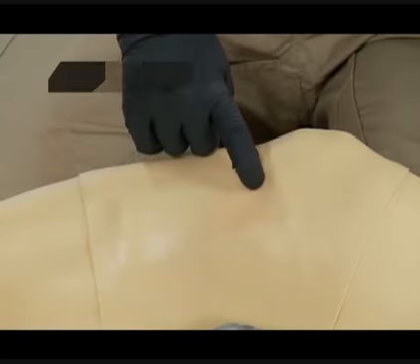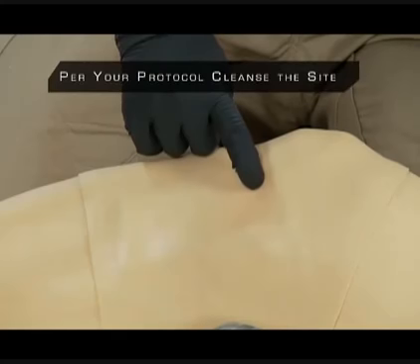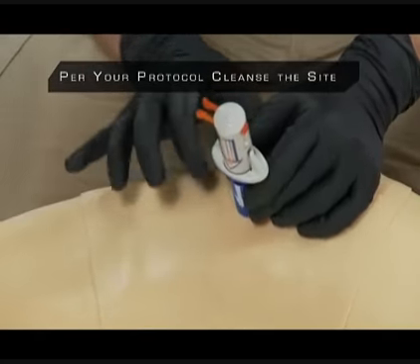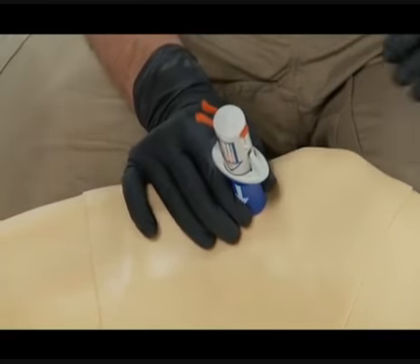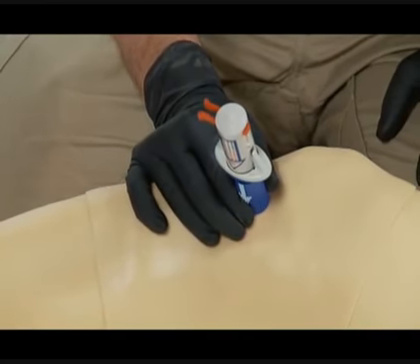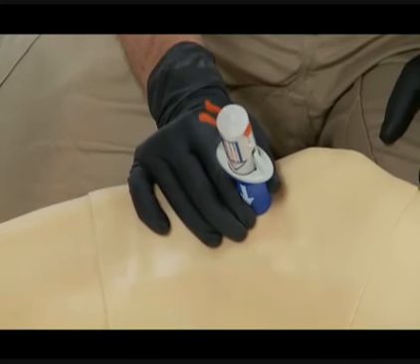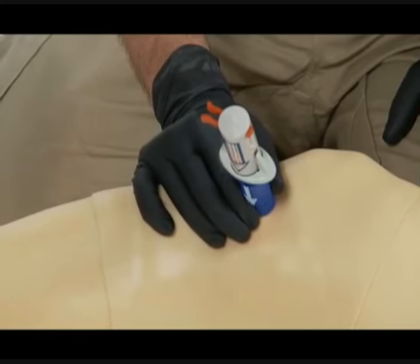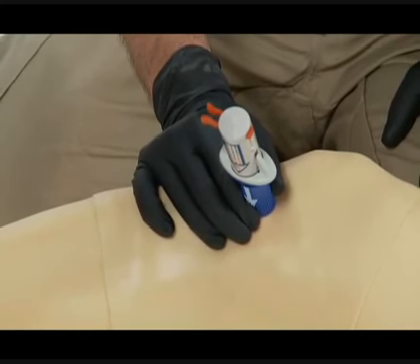Once placement and depth are determined for either device, use your non-dominant hand to hold the red or blue barrel firmly at the penetration site. Hold the BIG at a 90-degree angle using the aseptic technique throughout. Lay the palm of your hand on the leg while holding the BIG in place. This will add stability to the technique.